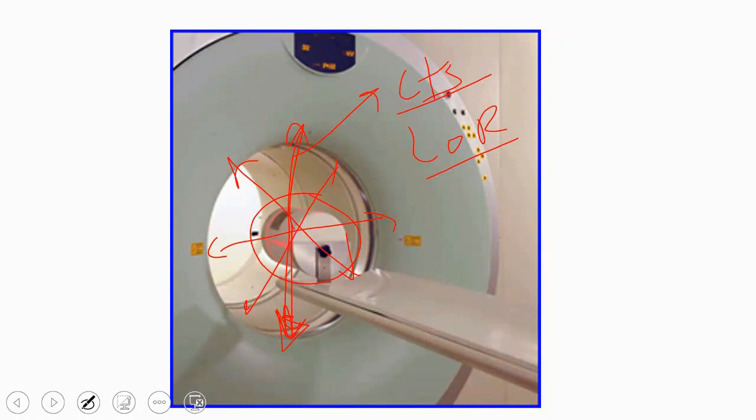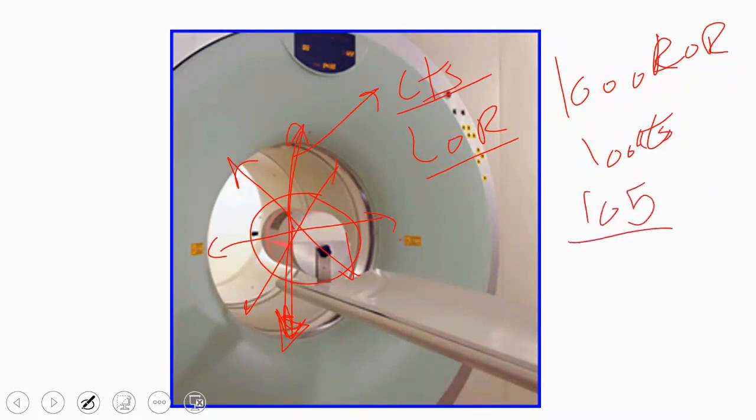So what am I doing? I'm correcting these values. So what should I do? I take the average, meaning, for example, these 1,000 lines of response, each line gave you 100 counts, right? Okay, each line, so their average is 105. The average is 105, right? Okay, you have one line at 100, one line at 95, and one line at 110. So what do you want to do? You want to adjust these detectors so that they all become homogeneous.